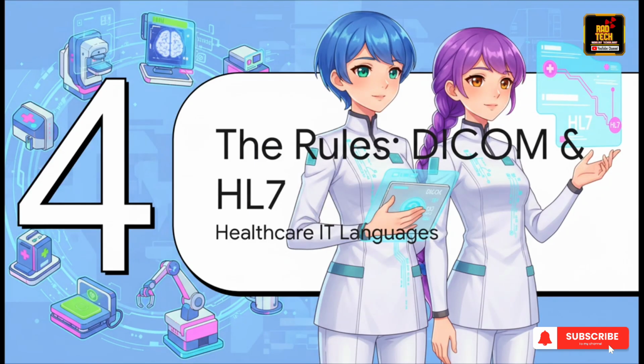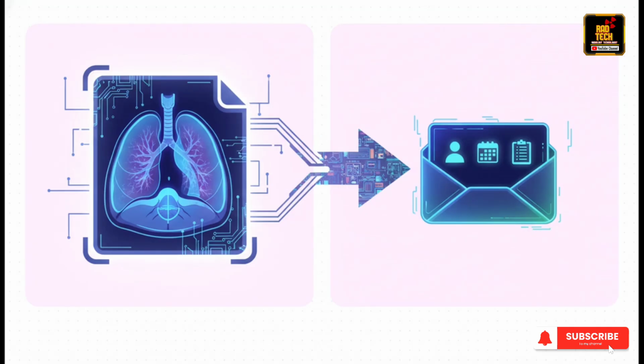Okay, so for all these different machines and computer systems to work together so smoothly, they all have to speak the same language. And in healthcare IT, there are 2 universal languages that are just absolutely critical to know about. The key here is to understand their different jobs. DICOM is the language for the images themselves. Think of it like a PDF, but for medical scans. It's a universal container that every single machine can understand.